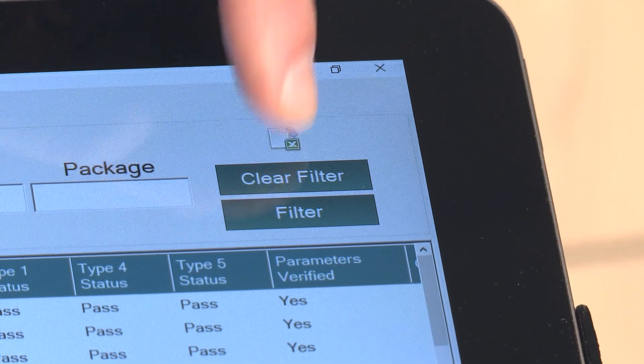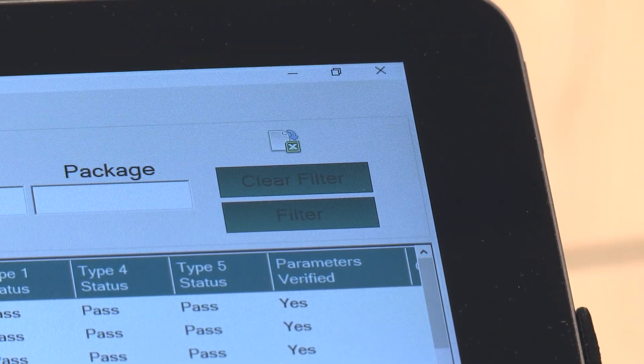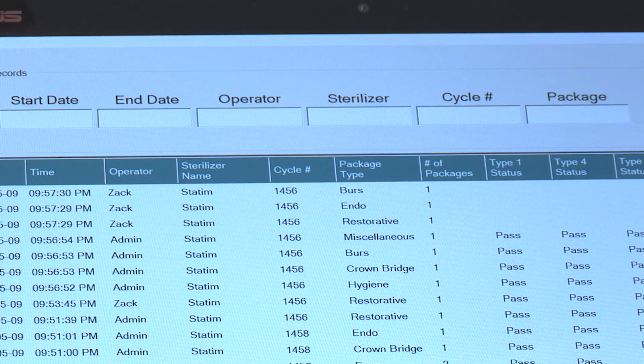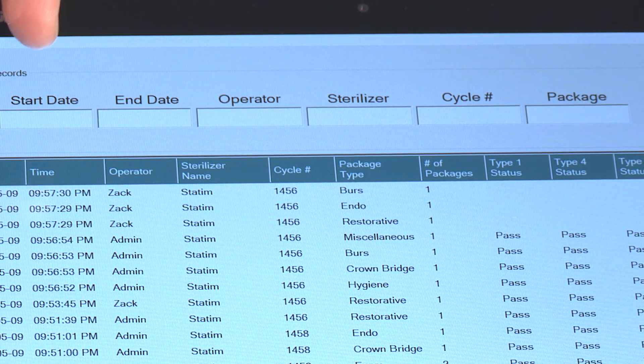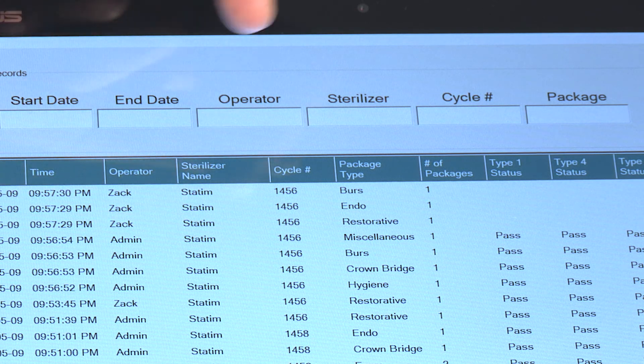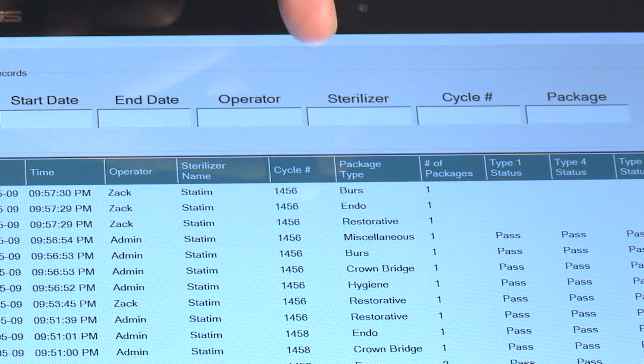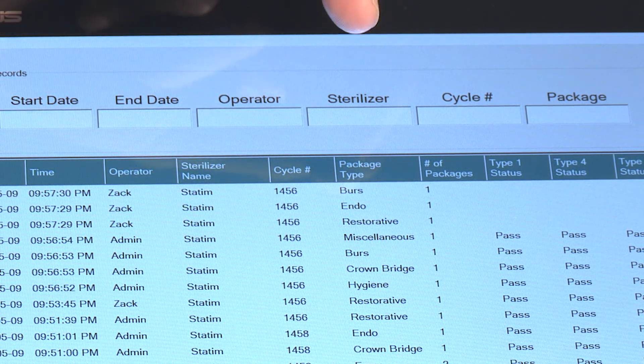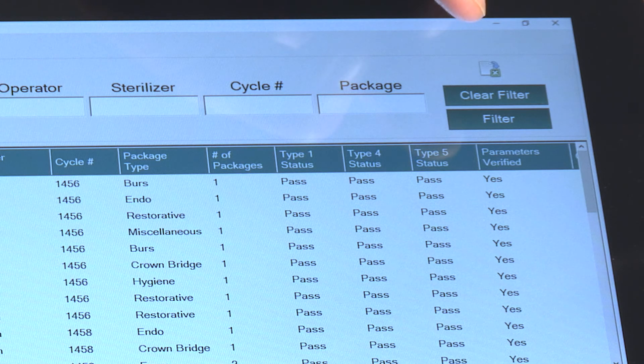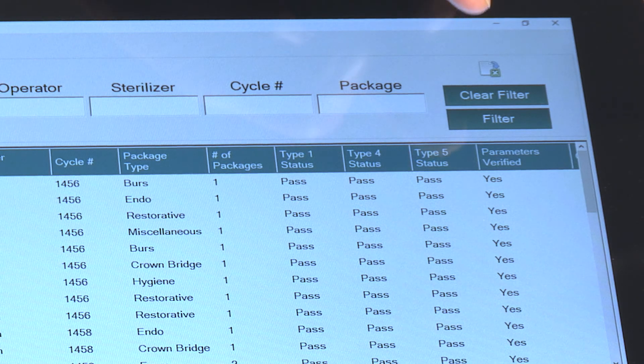To filter on a particular set of criteria, simply enter them into the fields over here such as a date range, an operator, a particular sterilizer or cycle number, and hit the Filter button.